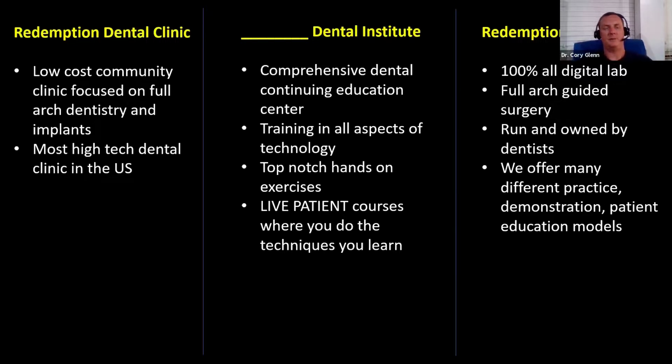For the lab, again, we're 100% digital. We don't ever want to see an impression or a piece of stone. Everything's going to be done off scans. It's run and owned by dentists. Myself and Ben, we're both dentists that have done a lot of this complex work, and so we're last eyes on everything that we do. We'll be able to fill a niche that many labs cannot do because of not having that treatment planning background of knowledge, a lot of full arch surgical guides, a lot of things like that.